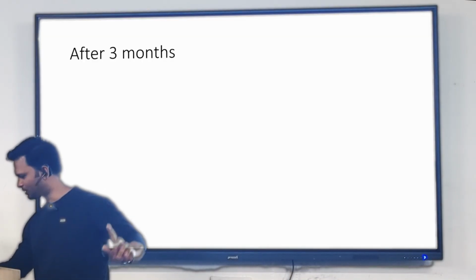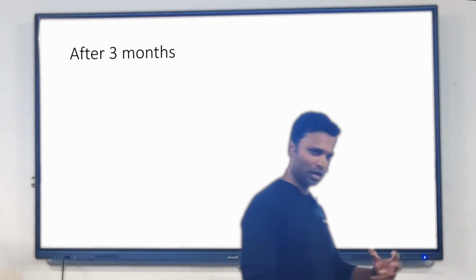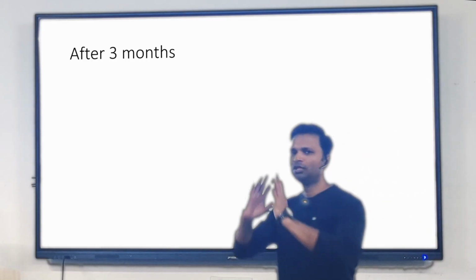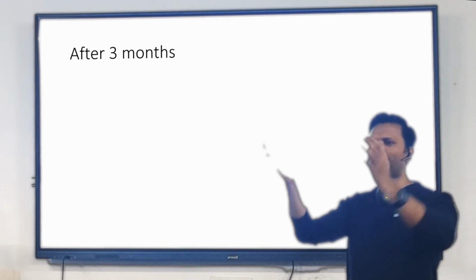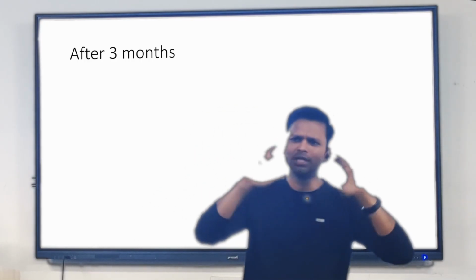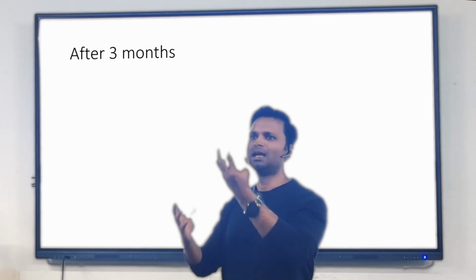So after 3 months, you take a radiograph. Now that you're sure, after the radiograph, that the implant has osseointegrated, then what you're going to do is open up the flap. Now the flap is totally closed, right? The implant is inside the bone. You need a proper collar of the gingiva around the tooth to receive the prosthesis, right?